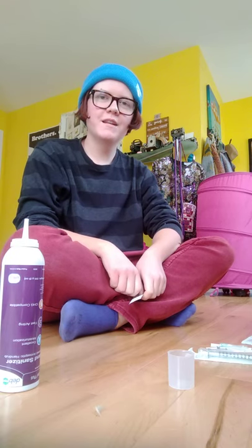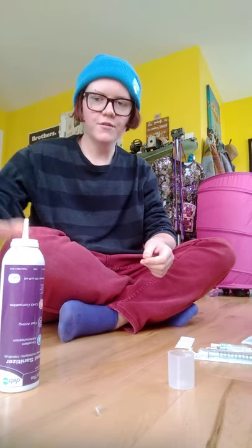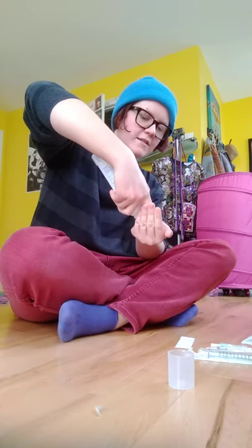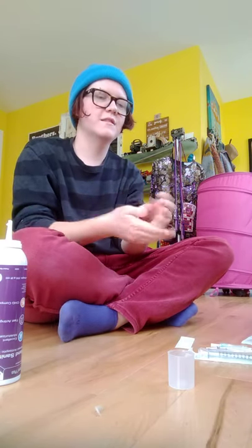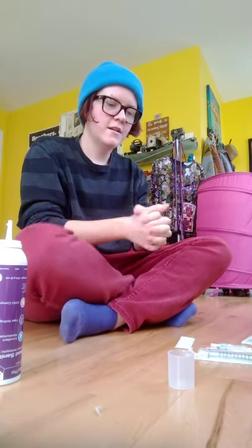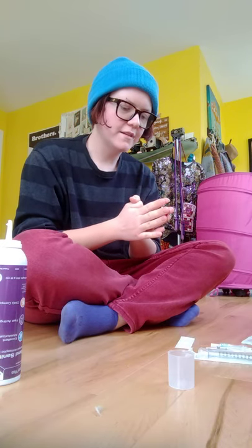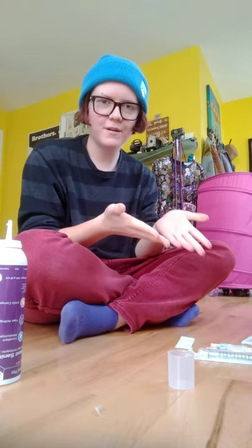Hey everyone, it's Julian. Today I'm going to show you how to do a T shot. First order of business, you've got to sanitize your hands. You can use hand sanitizer — this is the fancy kind. You need to sanitize your hands before you get out all your supplies, which I already did here.